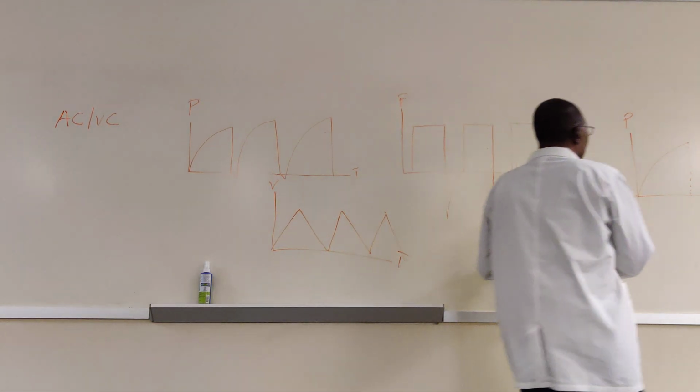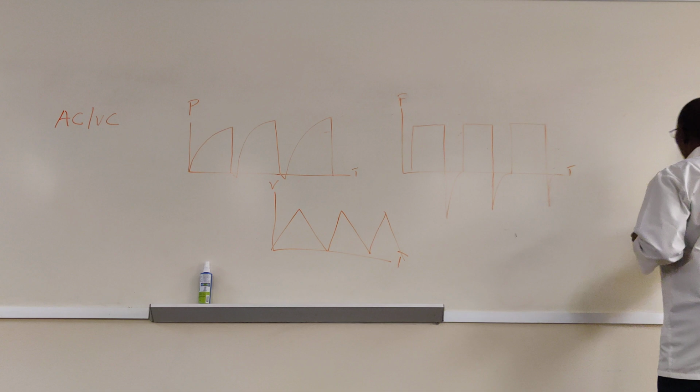Well, let's do SIMV VC, pressure support.